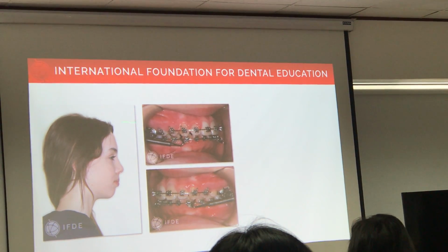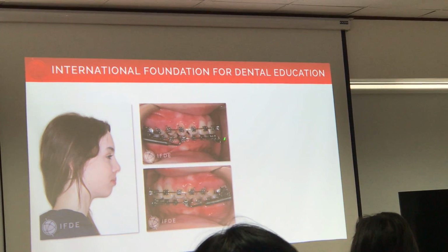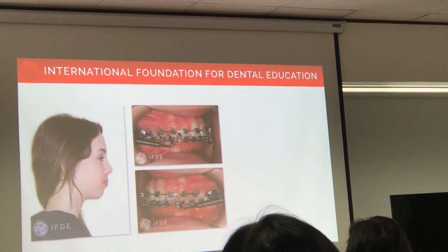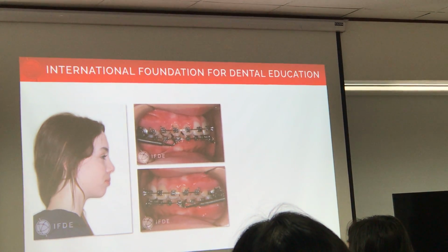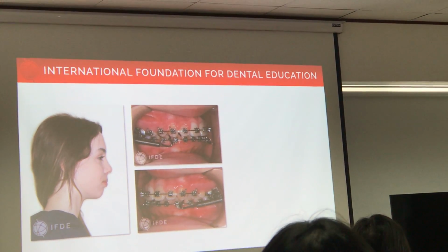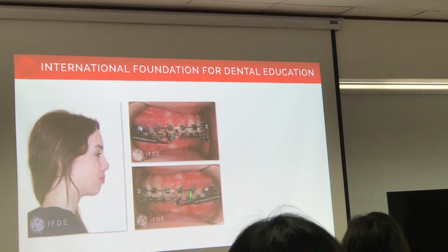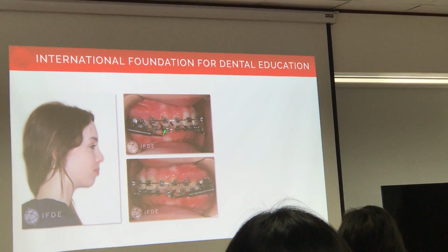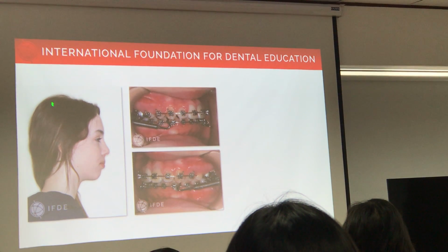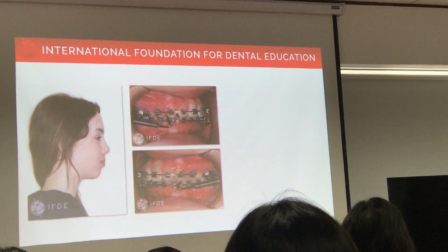So going back to this lady now, you see she's rebounding on me because you know why she's doing this? She was class 1, right? Then we lost it. We lost her when she came back. She didn't get the class 1 on this side. She's fine. On this side, she's not. And then she doesn't want the headgear no more. But look at the chin. You know what she has done while I was doing this?